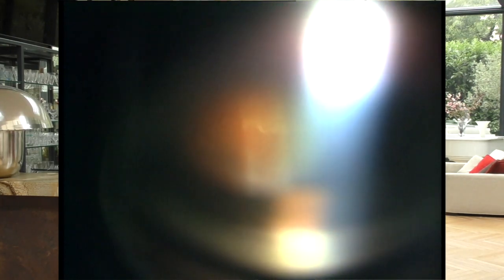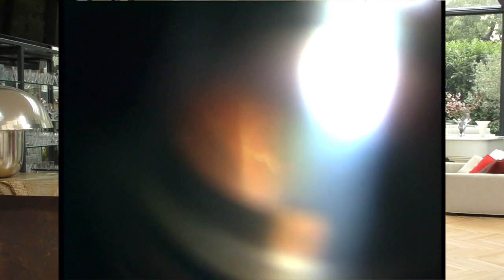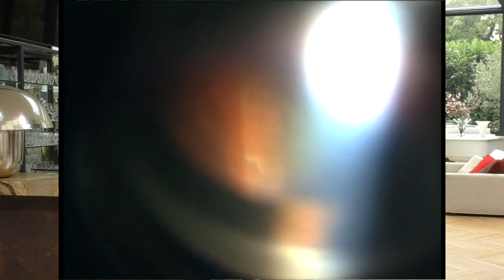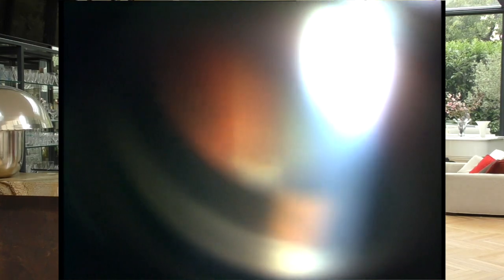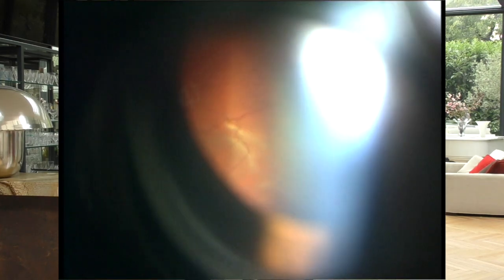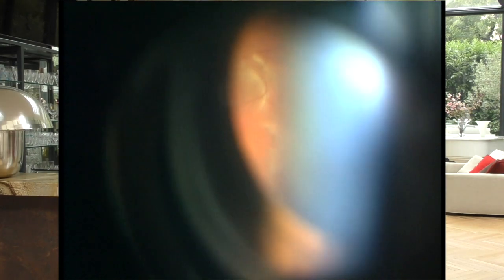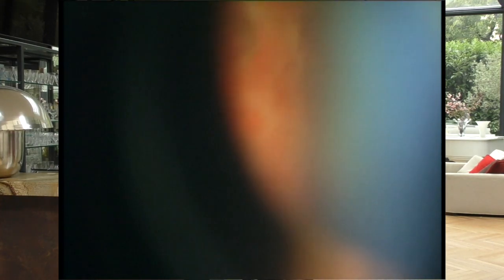You see that here all the tears are on the vitreous base, which appears as a small white line. Each millimeter of retina is examined continuously without making a jump. Nothing can therefore be missed because everything is checked and listed at high magnification. I counted 5 tears and 2 suspicious areas to be checked intraoperatively.